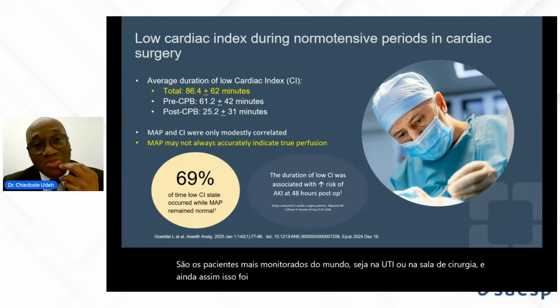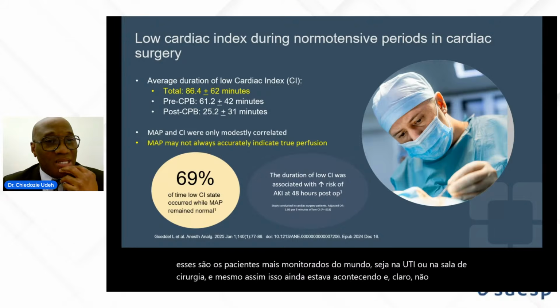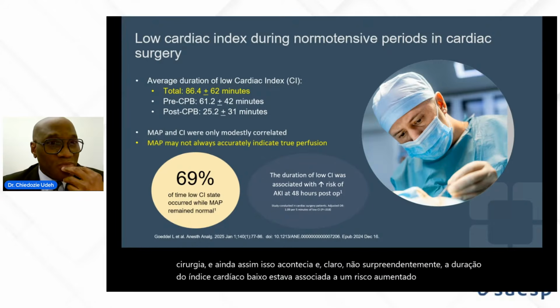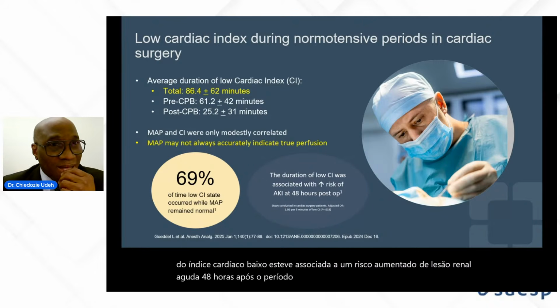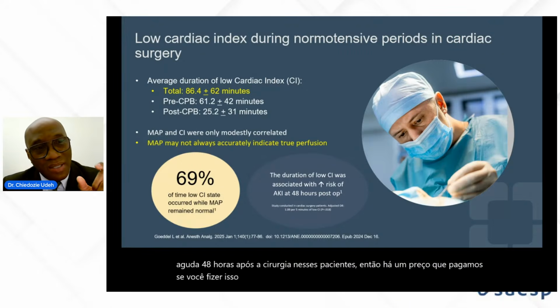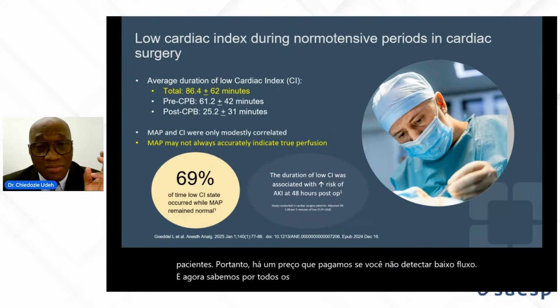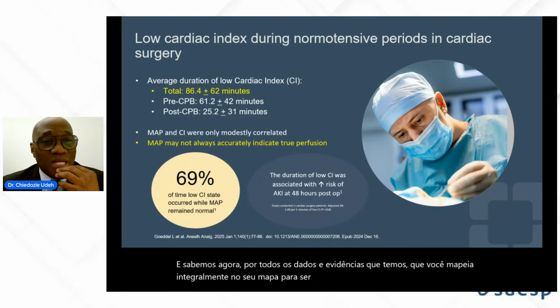And of course, not surprisingly, the duration of the low cardiac index was associated with an increased risk of acute kidney injury at 48 hours post-operatively in these patients. And so there is a price we do pay if you do not detect low flow. And we do know now from all the data and evidence we have that your MAP could be normal, and yet you're accumulating an oxygen debt.